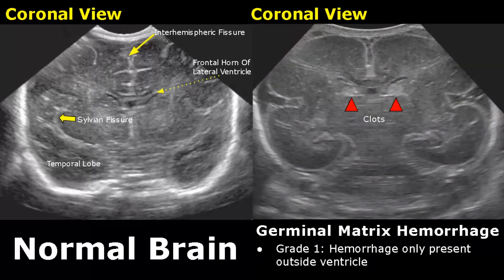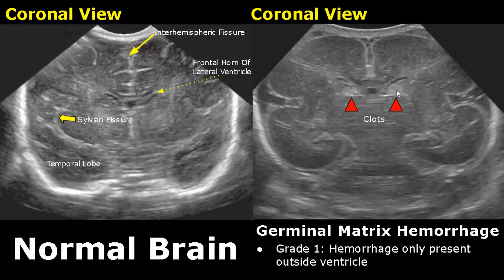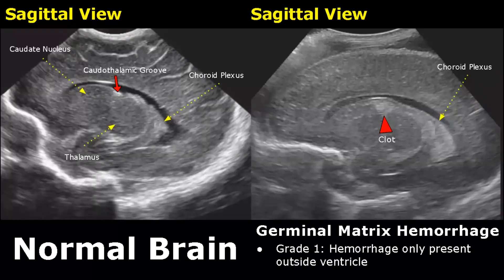Most intracranial hemorrhages in neonates are germinal matrix hemorrhages, also called periventricular intraventricular hemorrhages. They mostly occur in premature infants. This has four grades. In grade one, the hemorrhage is only present outside the ventricle — we will see hyperechoic clots outside the lateral ventricles. This image in sagittal view shows a clot outside the ventricle — this is grade one germinal matrix hemorrhage.